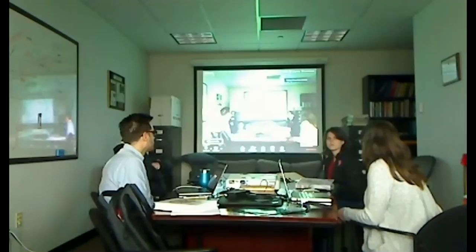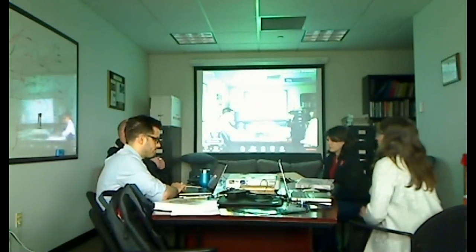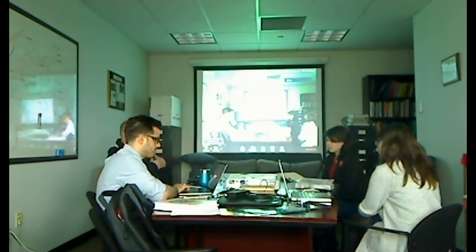I thought we were going to not within the FL pipeline folder. Well, no, I think it is. Sorry. We talked about some way of having the FreeSurfer recon directory at least in a standard location, and then if we had something where really it's pointers to those, the location is going to be different for each subject, but it'll be consistent.